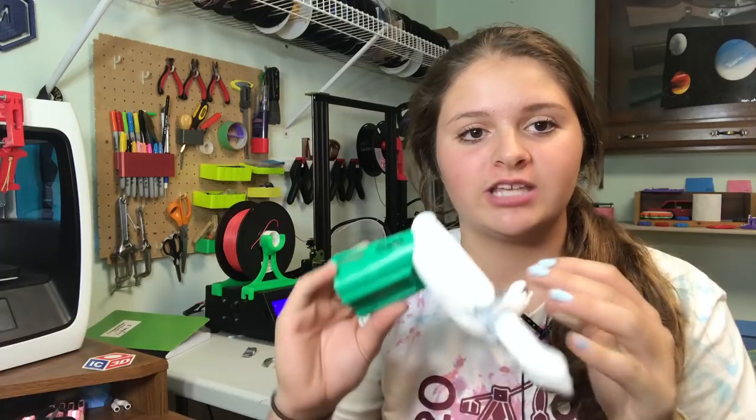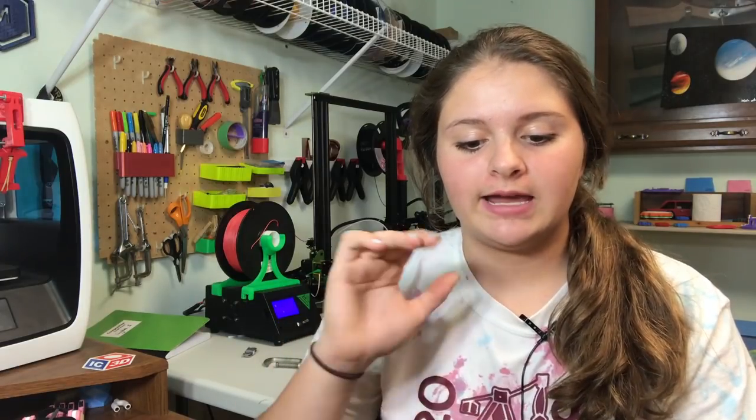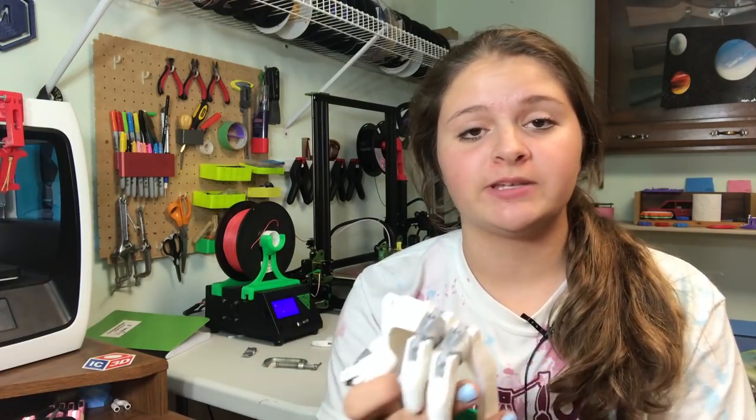I'm going to show you step-by-step how these hands are built. I have all these pieces 3D printed already, and then I'm just going to show you how I put them together — a little bit more in detail than my last video on these hands where I just did a bunch of time lapses. Let's get right started with the tutorial.